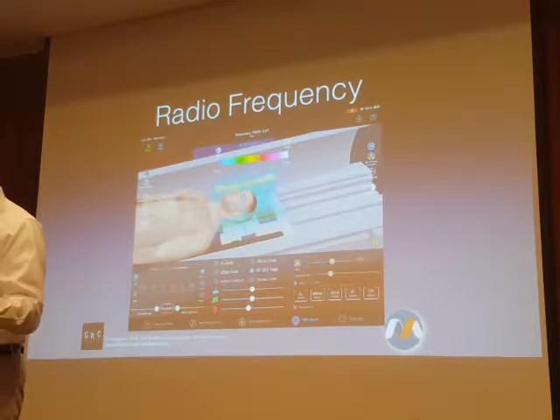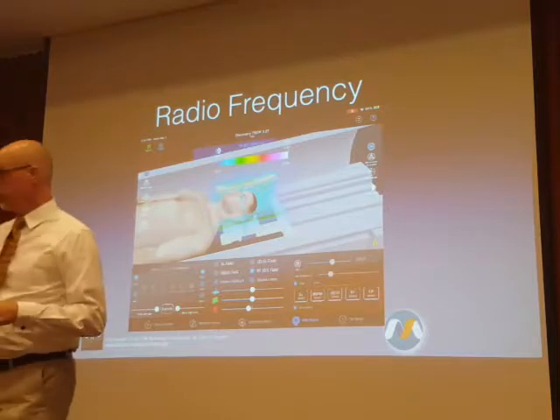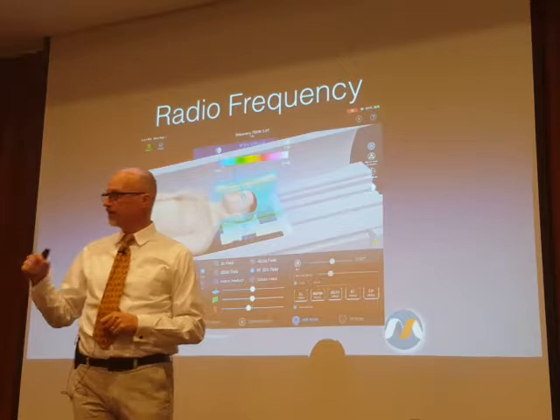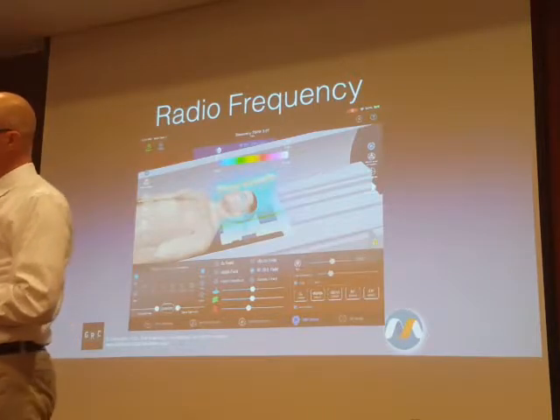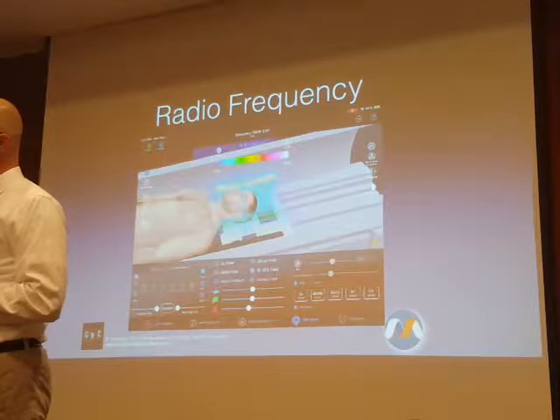But for a larger patient, by all means, you should make sure that there's more than just their clothing, or a gown or a bed sheet, that separates them from the walls of the bore. You should use a padding that is at least the minimum thickness that's called out for that particular system. And I think the short example alone, like brain and whole spine will take around 1.5 hours, and C-spine will take maybe 15 minutes.